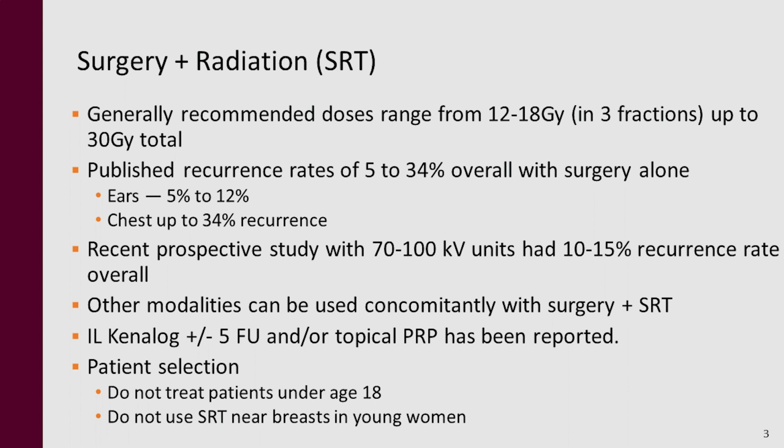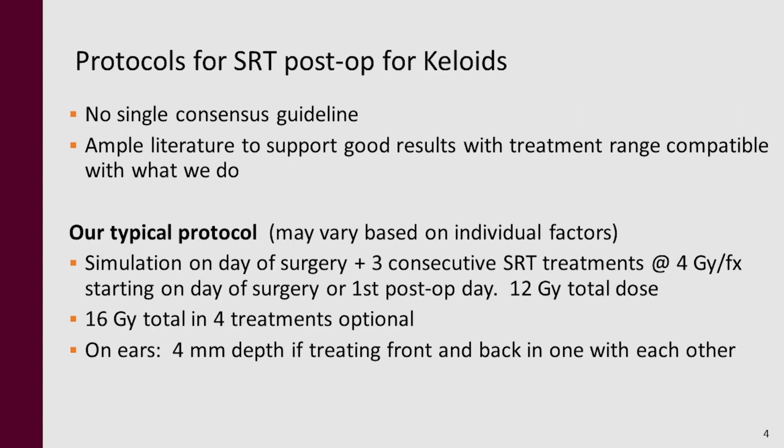The other thing I won't do is if they have a keloid on the breast or near the breast. Even though the risk should be very small, I'm not going to do SRT on a woman's breast, even though the risk of inducing cancer should be very small. So those are just some of my rules. There really is no one consensus guideline. You can look at the literature all day and see the different things. And I pretty much went over on a previous slide what I do.